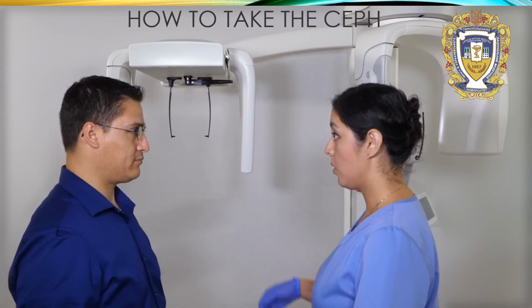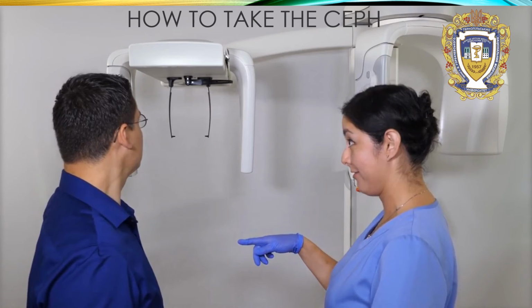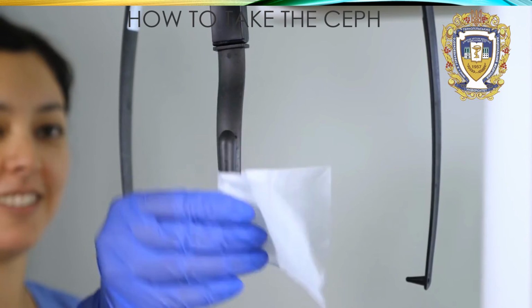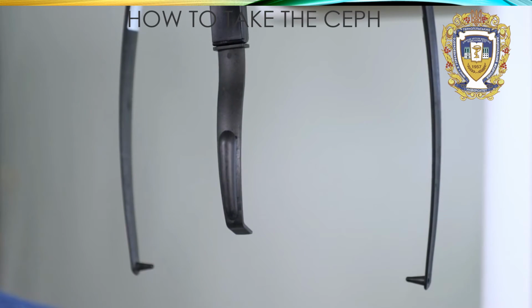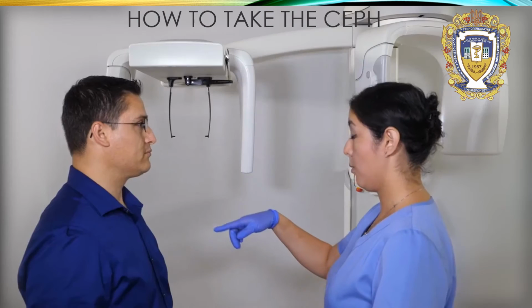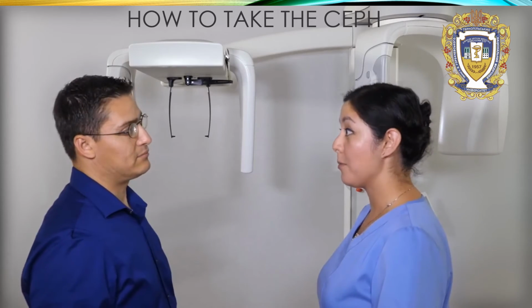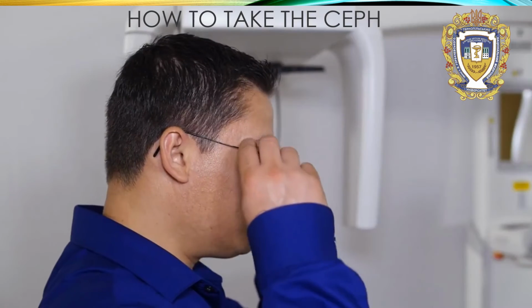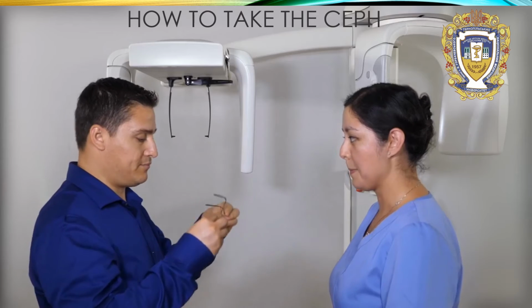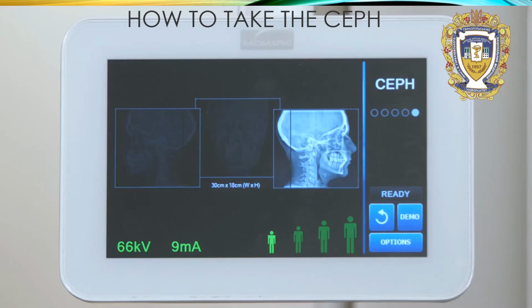Now that the Ceph function is chosen, explain the examination to the patient. Use a sanitary wipe or barrier on the Nasion marker and place the ear speculums on the otic posts. Explain where the patient will stand under the cephalometric attachment. Ask the patient to remove glasses and mouth or facial piercings, as well as a jacket or bulky sweater. You should now ready the machine for imaging to be in the patient entry position.